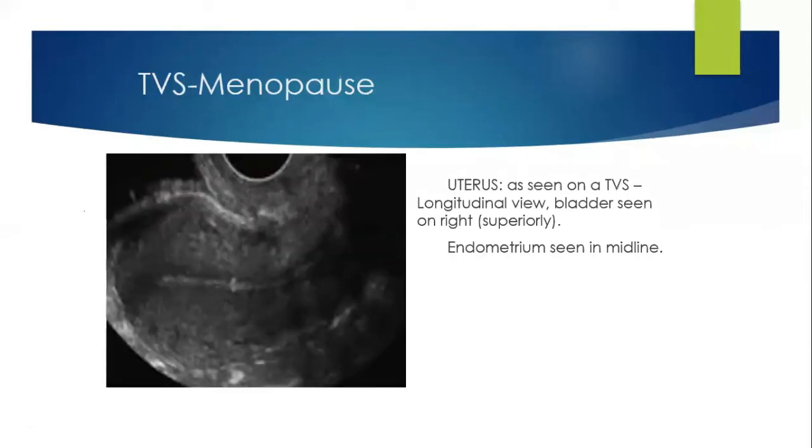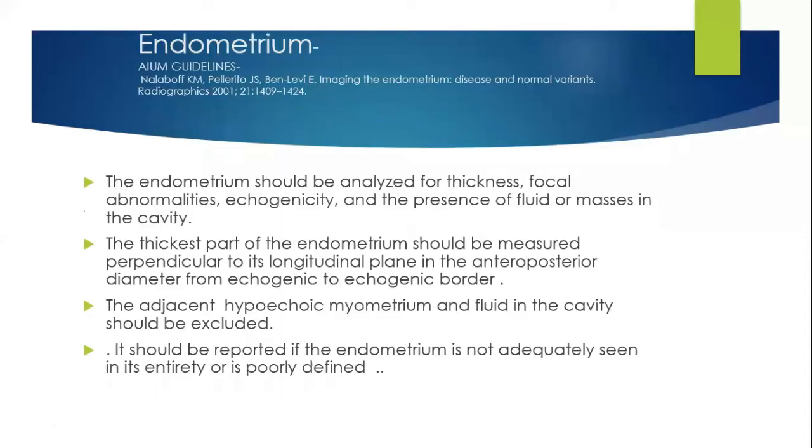So again, in transvaginal probe, I wanted to show you this picture, how a thin endometrium will look like. And I also wanted to show you this curve, that if you draw a line from this part till here, wherever this line is coming, this is the area of internal os. So in postmenopausal ladies, remember this, that we also need to be very, very careful in identifying where the cervix is.